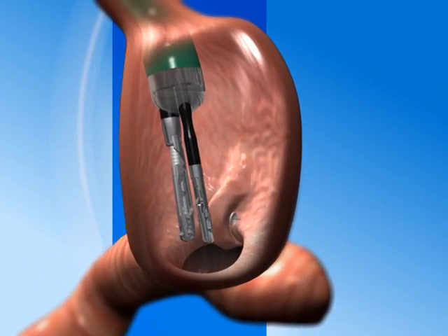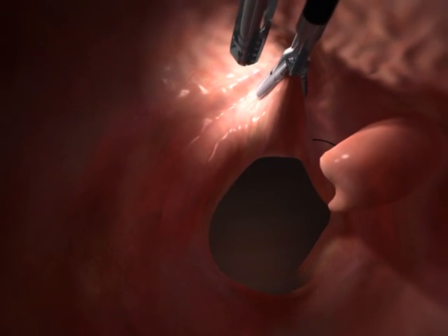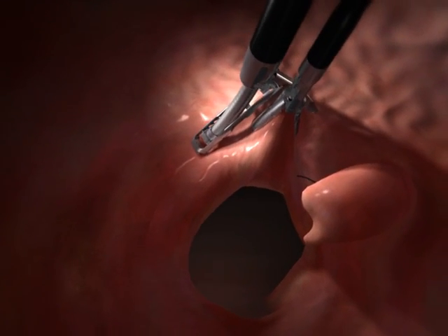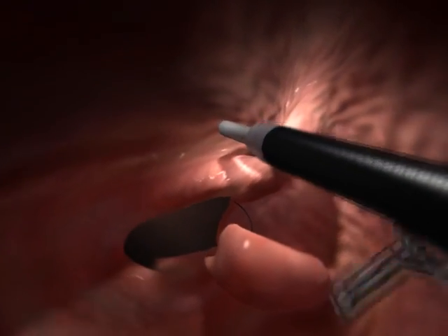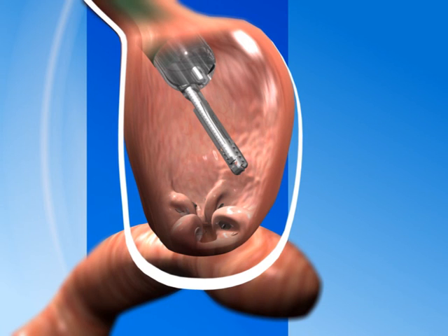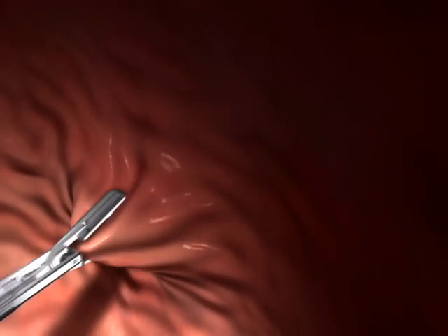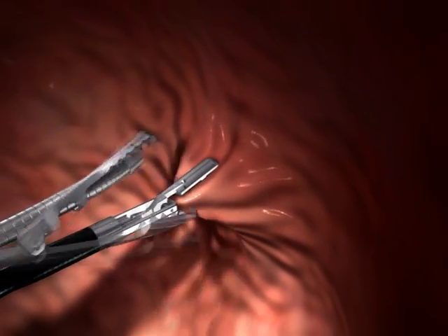The device is reloaded while in position at the operating site. Repeated several times, this process creates circumferential folds like a purse string around the stoma, substantially reducing its diameter while also reducing the size of the stomach pouch. If the pouch is still too large, additional folds can be made in the stomach pouch until the desired size is achieved.